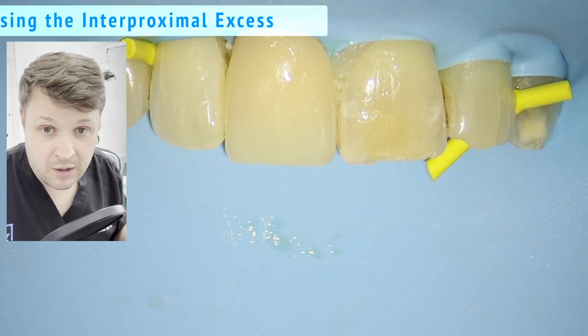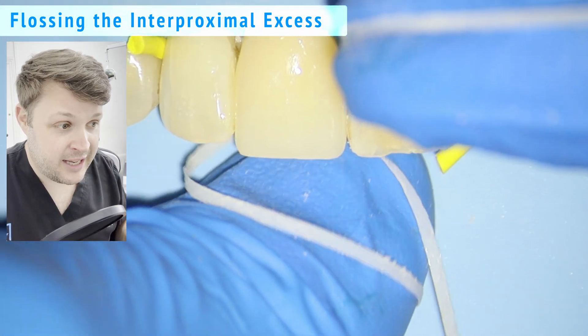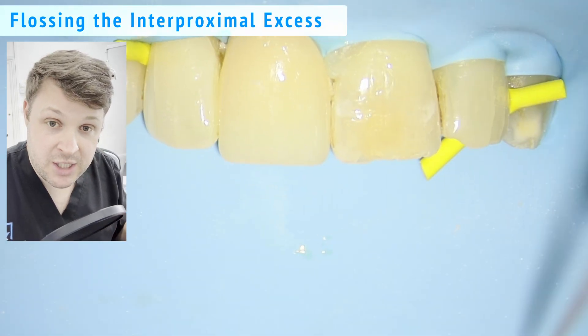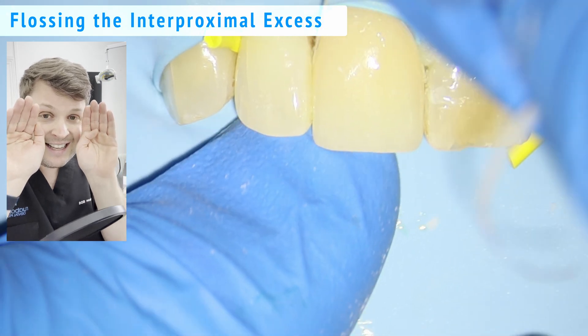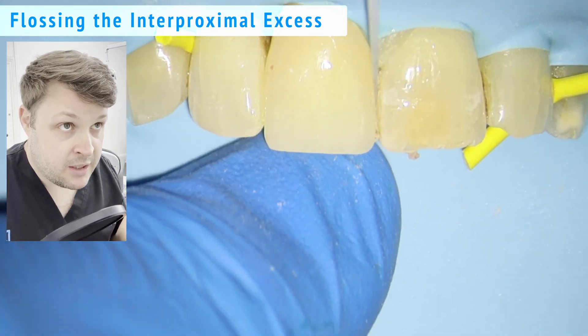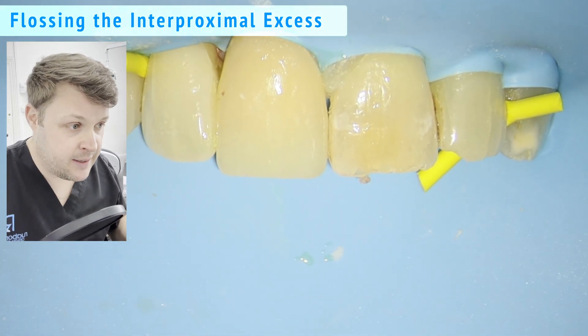I'm not entirely sure where I got this technique from — I may have made it up or seen it on Instagram — but it works really well, especially with rubber dam. If the gingival margin isn't too far up, you can tuck the PTFE in and it tucks the rubber dam into the sulcus more effectively than flossing it down would.